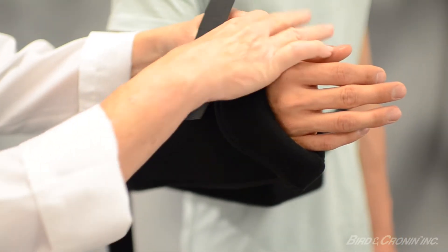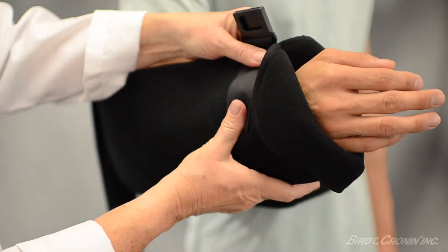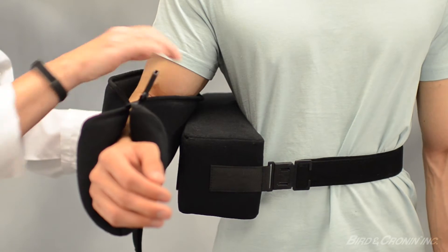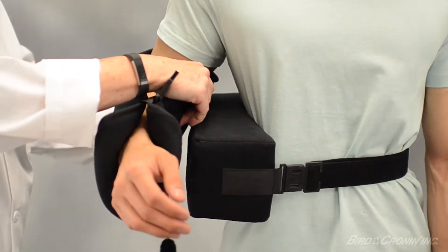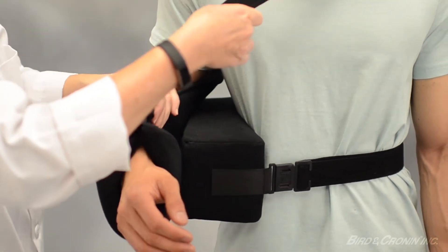Attach the Y hook connector near the end of the sling. Adjust the arm sling strap to a correct, comfortable length that positions the affected arm so that it is slightly elevated.